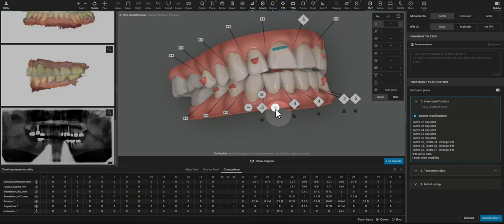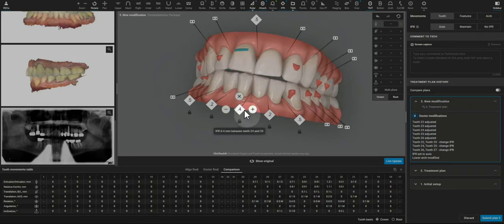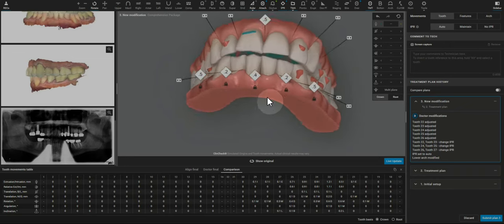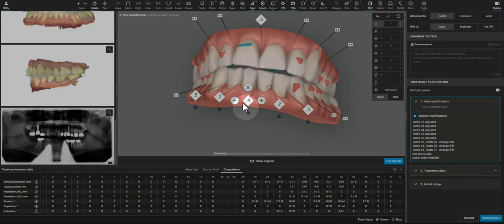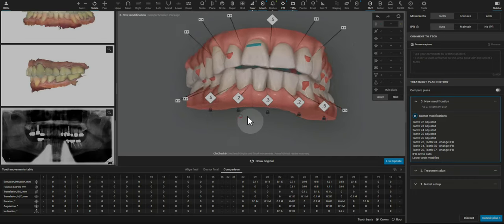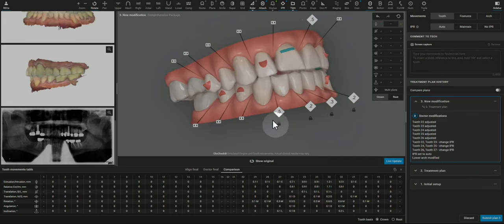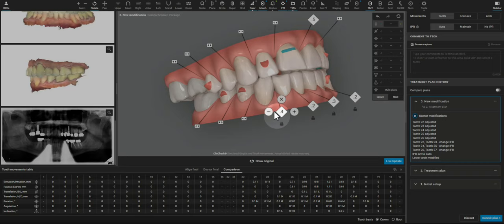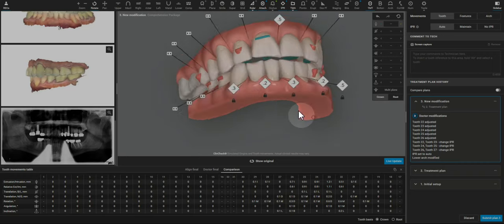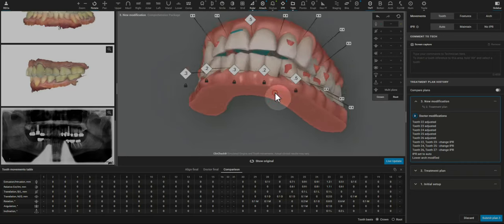And then here, I'm just switching up where the IPR is to have it be more focused where the black triangles would be. So that looks more appropriate to me.